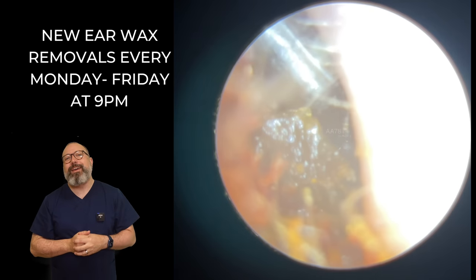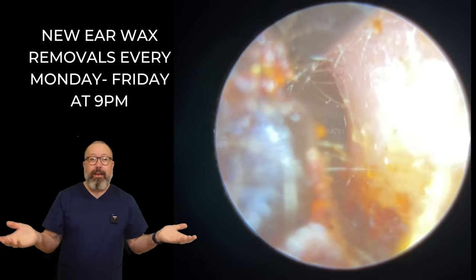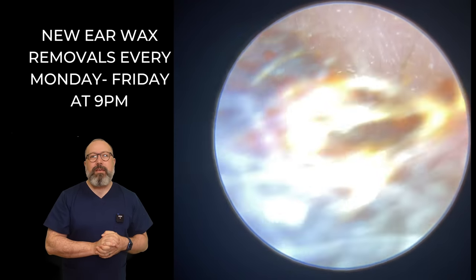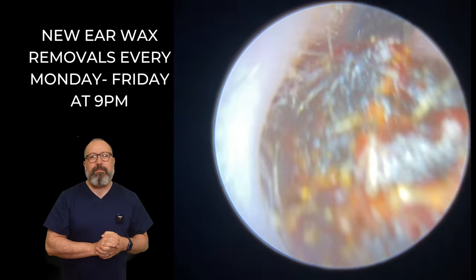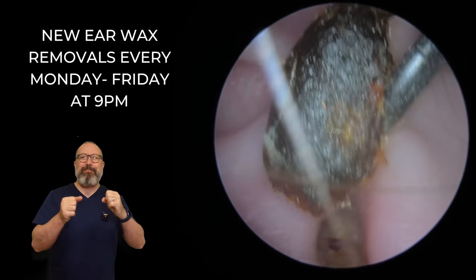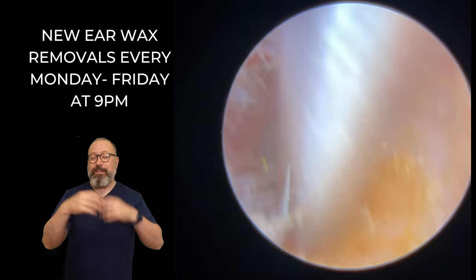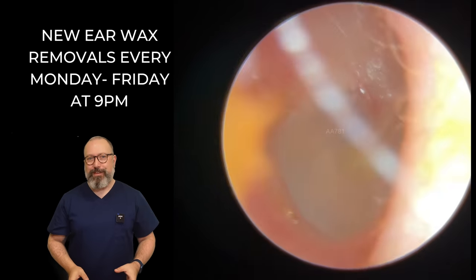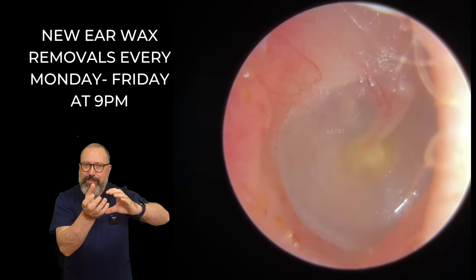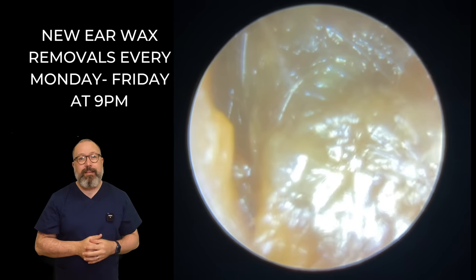So who comes into play? The St. Bart's hook. It's had a few outings over the last couple of weeks. As you can see, they're coming away really, really well. Out that comes. Perfect — look at that plug. That is a lovely plug coming away there. It came out really nicely. Absolutely perfect. We talked about Goldilocks zones for the wax removal and the consistency of the wax. You also have a Goldilocks zone for the St. Bart's hook — you've got to have that little gap, the wax has got to be slightly harder, and you've got to have enough room to get it through and twist to be able to pull that 90-degree angle down behind the wax to pull it out. It worked perfectly in that ear canal.